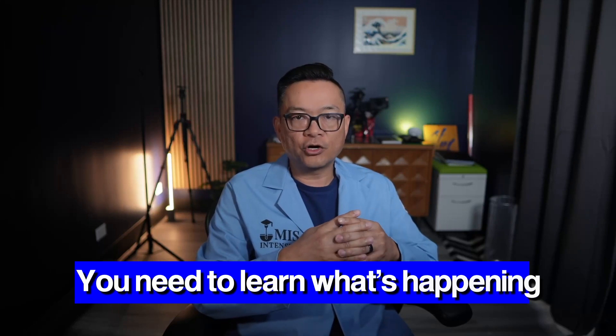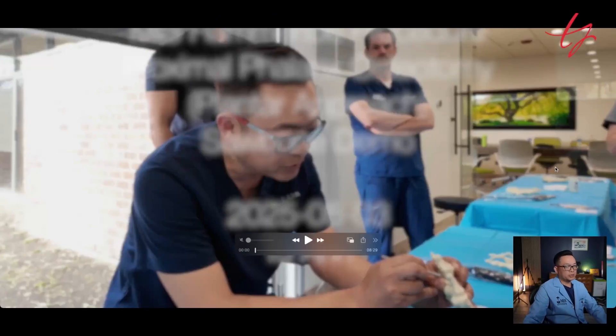Let's zoom out to sawbone to help you understand what's really happening beneath the surface. Because if you only watch the cadaver, you don't exactly know where you're cutting or what you're doing — you need to understand what's happening beneath the surface. This is a sawbone demonstration of hammertoe. It takes 15 minutes for me to do it, and I'm by no means rushing — I don't want any surgeon to rush this — but this is the normal natural workflow for the surgical procedure itself.